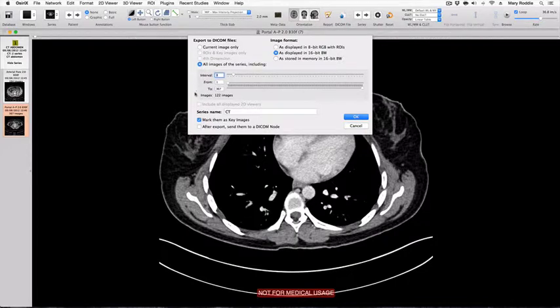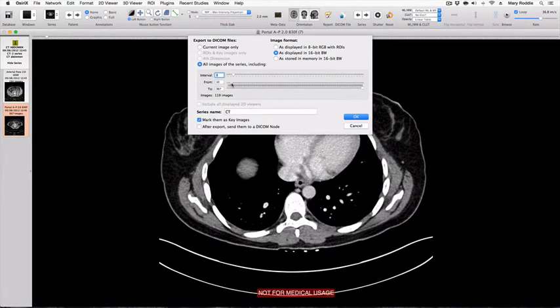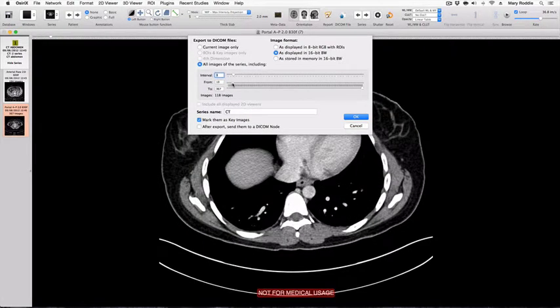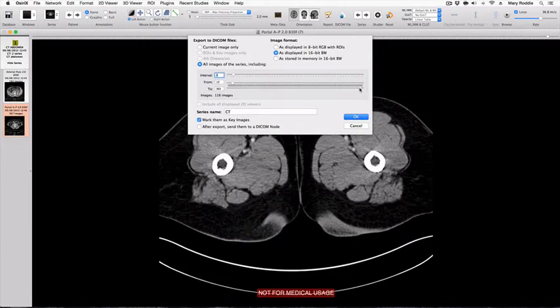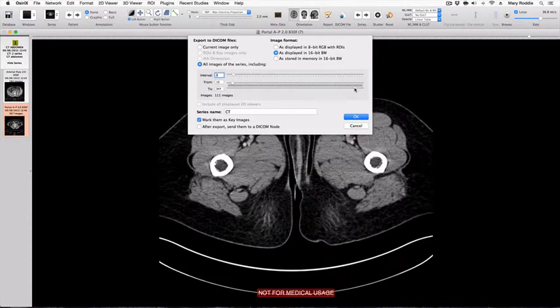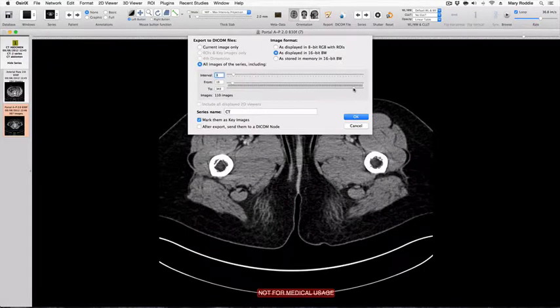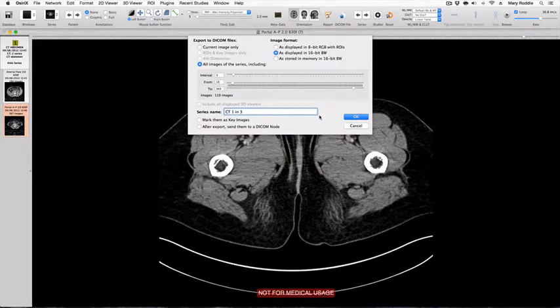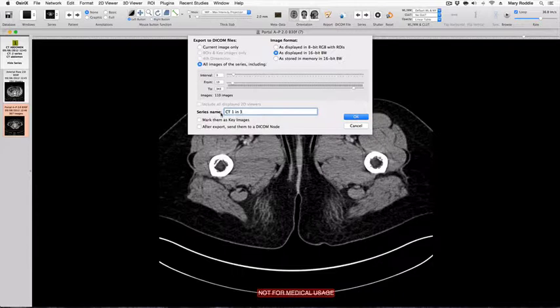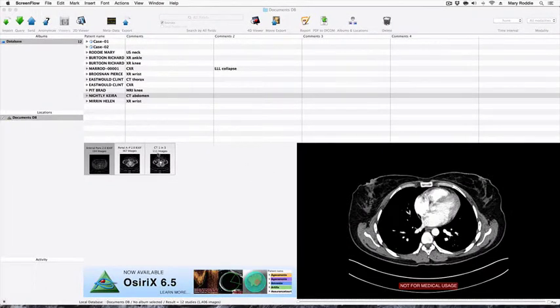We also have the option of trimming images from the top of the series by using this slider bar and trimming images from the bottom end of the series by moving the other arrow. This is a useful strategy if you have, for example, a CT of the chest, abdomen, and pelvis and it's only the chest or the pelvis that you're interested in. So having reduced this series size to 110 images, we will save it as CT 1 in 3 and press OK. We now have a new series containing only 111 images.